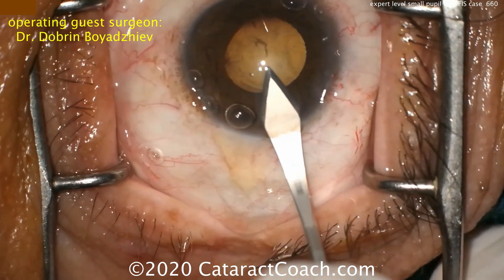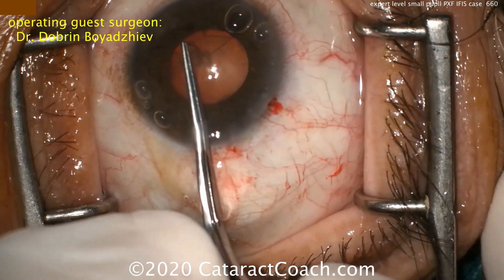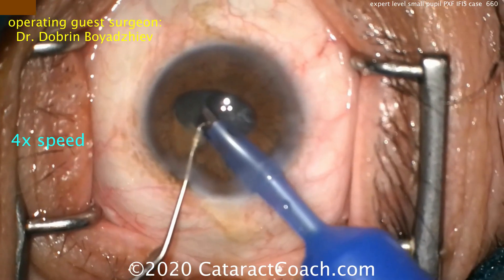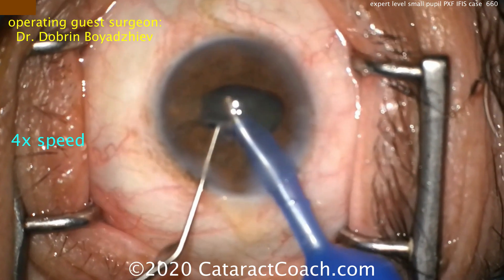Make the main incision. We're going to use forceps to create a larger capsulorhexis — even though the pupil is four millimeters or so, you can make a five millimeter rhexis. Now let's look at the nucleus removal; we sped up the video to four times speed.